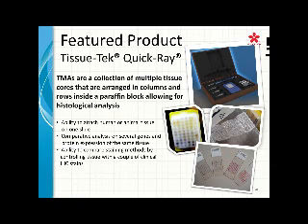You talked about the time of fixation and mentioned, what about leaving tissues in formalin for a long time? Do epitopes get more difficult to retrieve? Yes, yes they do. That's why sometimes, I'm going to use tonsil as an example, sometimes we let tonsil sit in formalin because tonsil is a very common control for a lot of immunos.